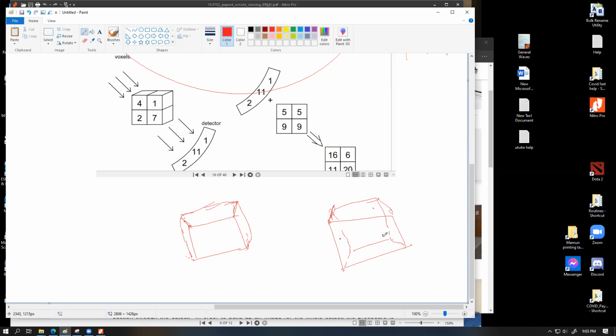Now we just want to know what is in this place, or this place, or this place, where the anomaly is. And in the report of a CT scan, what the doctors provide in print is sections of views of this anomaly, for doctors to be able to understand what is there. So the reports that we get from the CT scan diagnosis centers essentially tell us the locations of interest in the part that we did CT scanning on. They don't provide us the whole data, but the whole data can be obtained. If you ask a CT scanning operator, they can give you a whole CD where the entire data is burned.